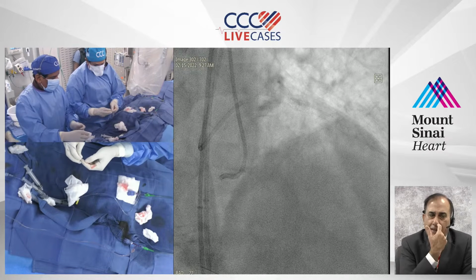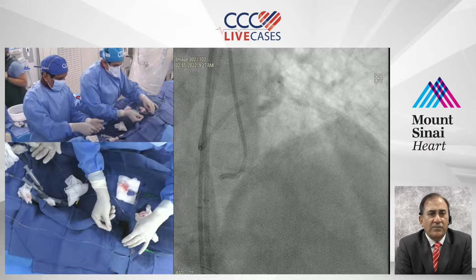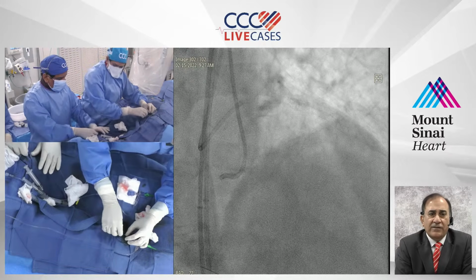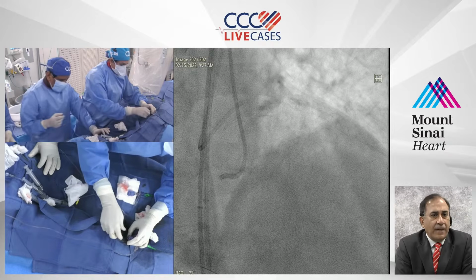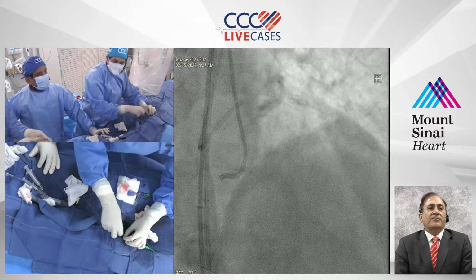What are the long-term effects? How does it act? You've had some patients who've come back, and the integrity of the struts which have been dilated through balloons or other, they are about the same? Yeah.